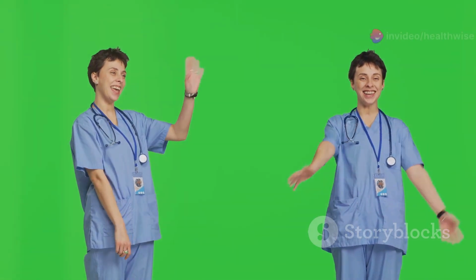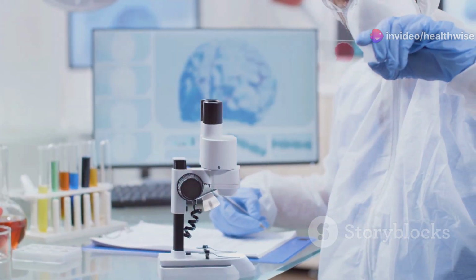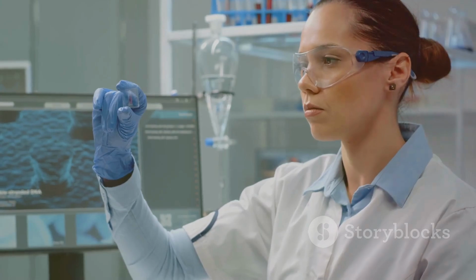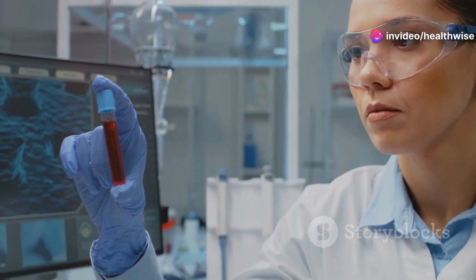Hey there, future doctors! Let's dive into the fascinating world of cerebrospinal fluid, or CSF, and how to estimate its protein content. Increased protein levels in CSF are a common abnormality and should always be measured quantitatively. Today, I'll walk you through some of the easiest and most effective methods to do just that.